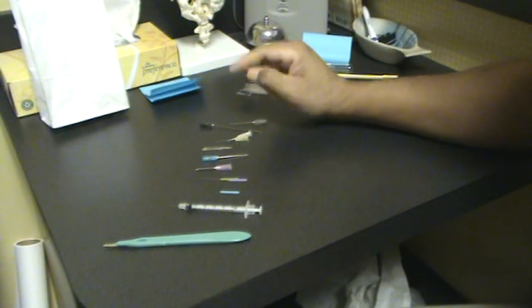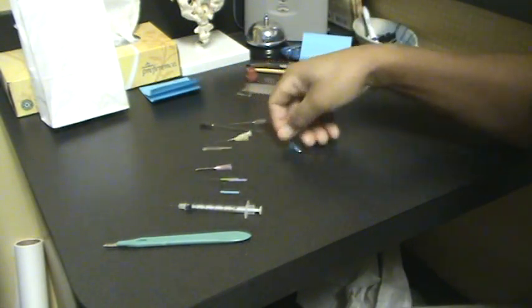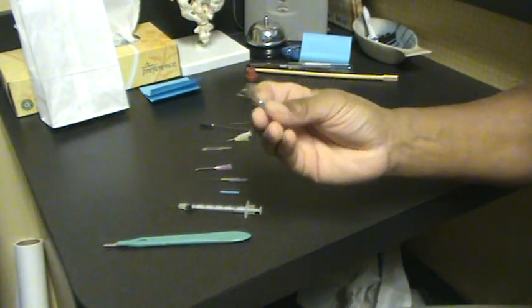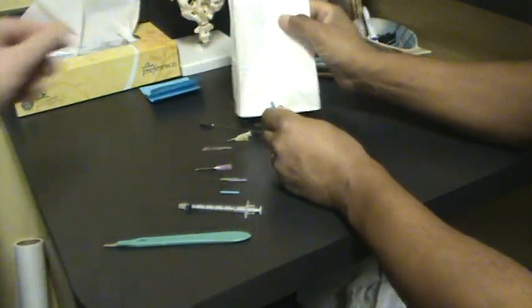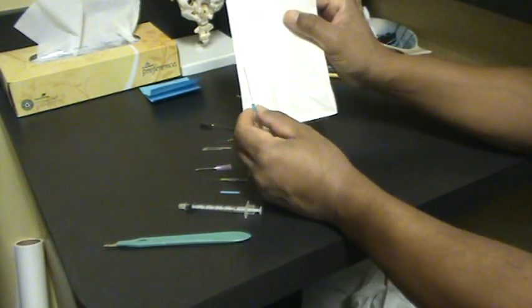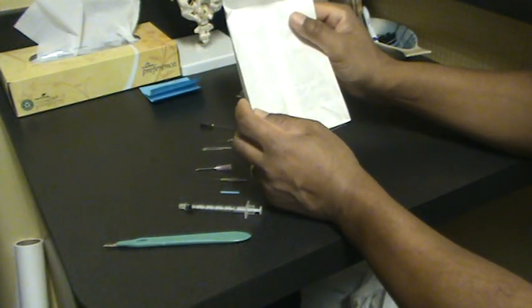That triggers the healing process — that's powerful. Number two is that the wire will enter the muscle. The wire will enter the muscle, and it will short-circuit the muscle, and the muscle will go through a reboot process.